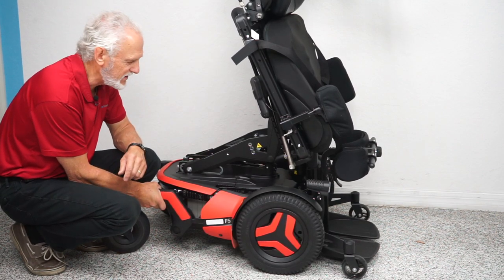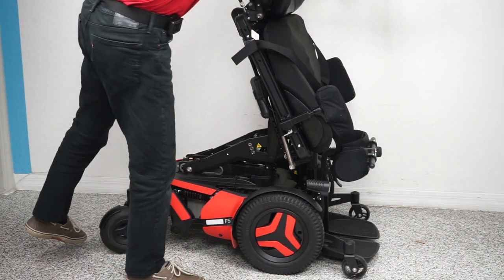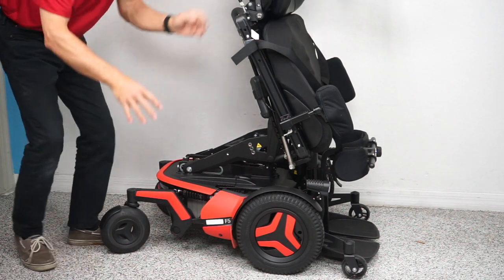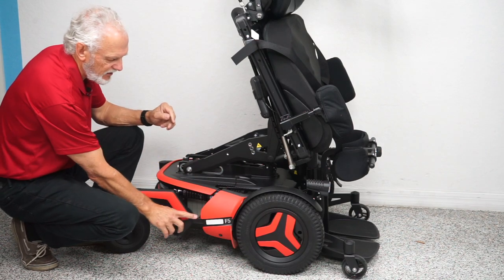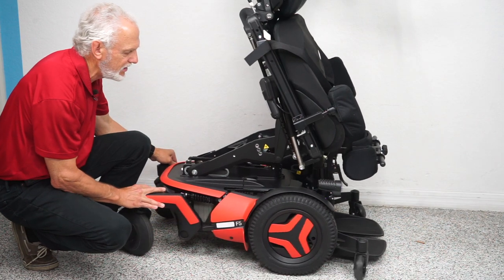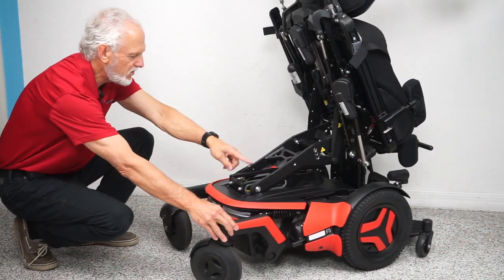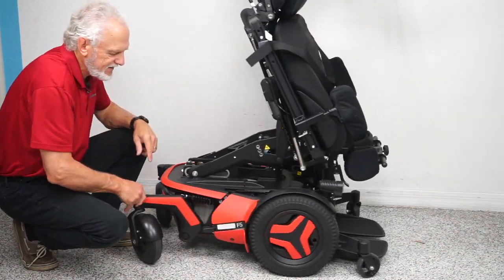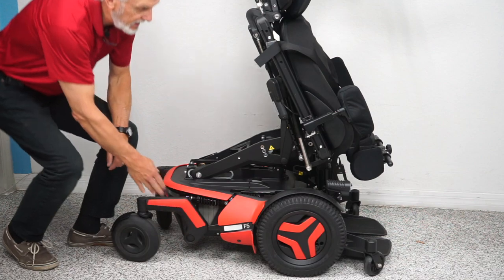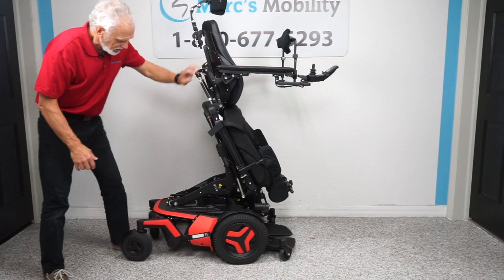If you want to push this chair, it won't go anywhere because it weighs 450 pounds and it's in gear. But if you turn the power off — ideally with the seat all the way down — the power is off, and this is your neutral handle right here. Push it down and now the chair rolls freely. You need to do both motors on both sides. That's how you put the chair in neutral. When you're done, put it back in gear, then turn your power back on.